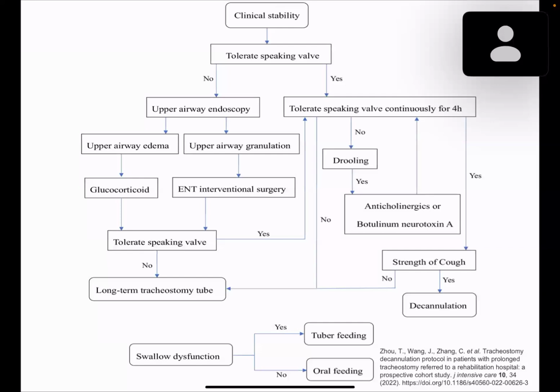Because they're long term, like the patient is six months, nine months on a tracheostomy tube. Suppose there is a subglottic granuloma, we can't take out the tracheostomy anymore. The patient is walking, but still that patient is on the tube. Because we can't, the ventilator passage may need a total repair or replacement of the trachea. So in this kind of situation we put them on a metal tracheostomy. Most of the brain injuries and comas which I am seeing are long term, so down the line they are all put on a metal tracheostomy tube.